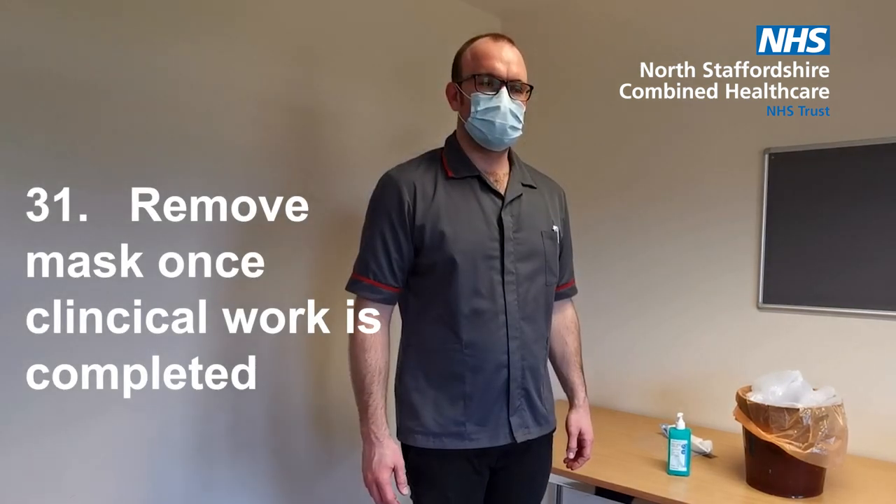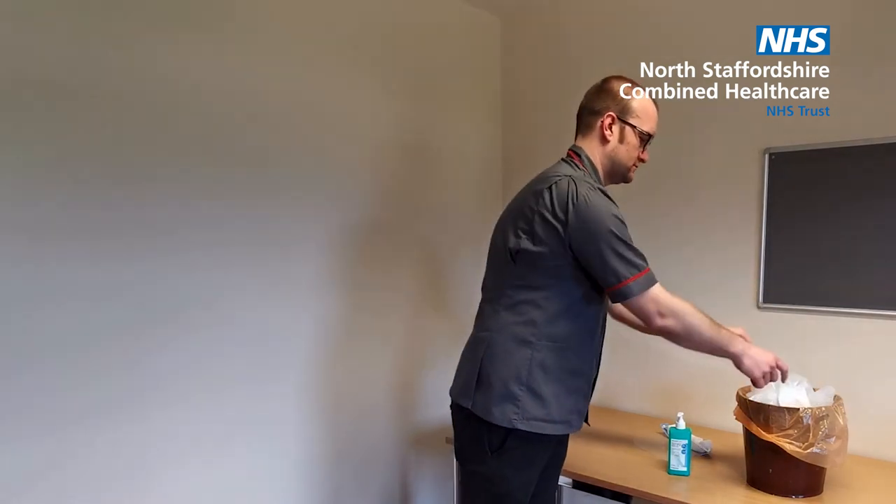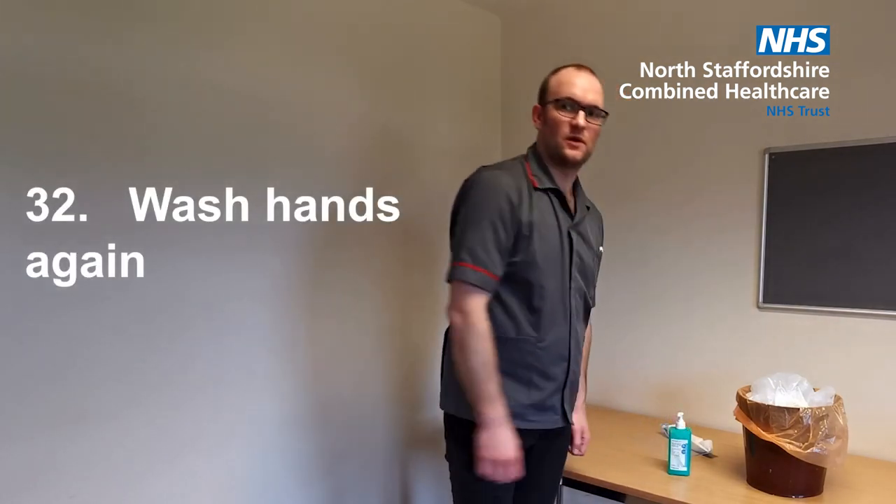Remove the face mask once your clinical work is complete. Take off your face mask and discard. Wash your hands with soap and water or alcohol gel.